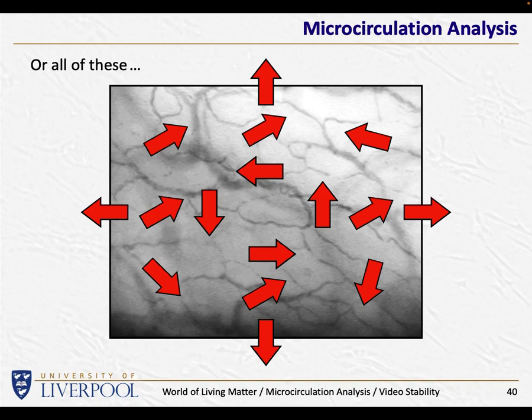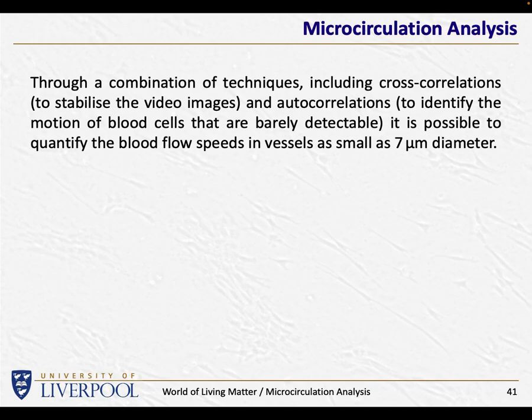It's going to move and rotate and change magnification, and the patient might be on ventilation. And the patient quite definitely will have a heartbeat, and therefore the whole thing will be jumping up and down. So my problem was, how on earth can you monitor these blood cells when there's all these things going on? And again, I'm not going to bore you with the details, but it took me months and months and months to figure out how that could possibly work.